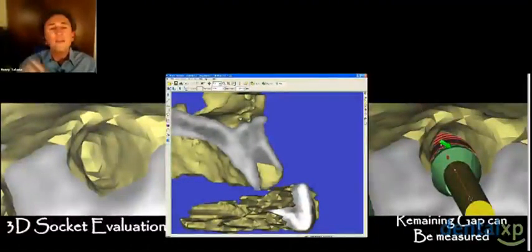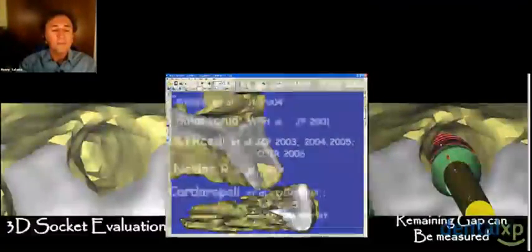Your effective distance as it relates to the biologic width is actually from where the future restorative abutment will come out of the implant to the labial plate. That's the effective distance. And if you can keep that at 1.5, your influence on that labial bone relative to biologic width remodeling will be minimized. That's why we incorporate implant design in our decision making.